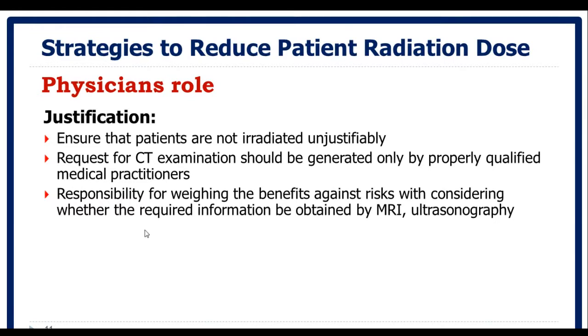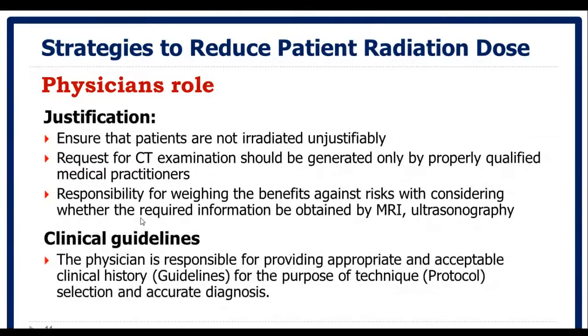In addition to this, the clinical guidelines. We are the technologists, and many of us sometimes face problems associated with these clinical guidelines. Without having clear clinical guidelines, the technologists will not be able to apply the correct protocol and select the required protocol parameters in order to apply those parameters that could help in minimizing the radiation dose.